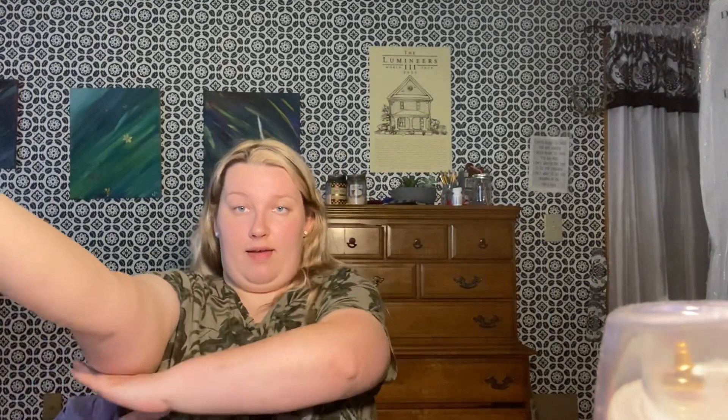With the resident seated and reclining with the lower arm on a flat surface, expose the arm as much as possible. Put the cuff on their arm — I was always told to line it up with the brachial artery. Usually the blood pressure cuffs have an artery marking line on them. Squeeze the cuff to expel any remaining air, then turn the valve on the bulb clockwise to close it. Wrap the cuff snugly around the upper arm, at least one inch above the elbow.